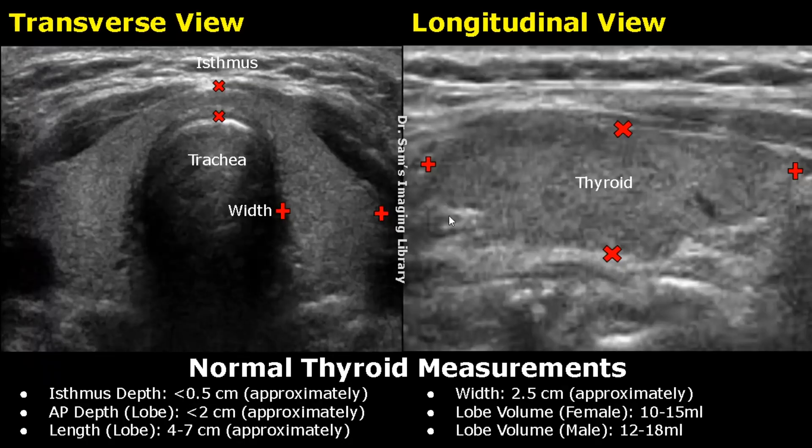Over here, we have a longitudinal image of a thyroid lobe. We can measure the length and the depth. The length is measured by placing one caliper at the superior margin of the thyroid and the second caliper at the inferior margin of the thyroid.